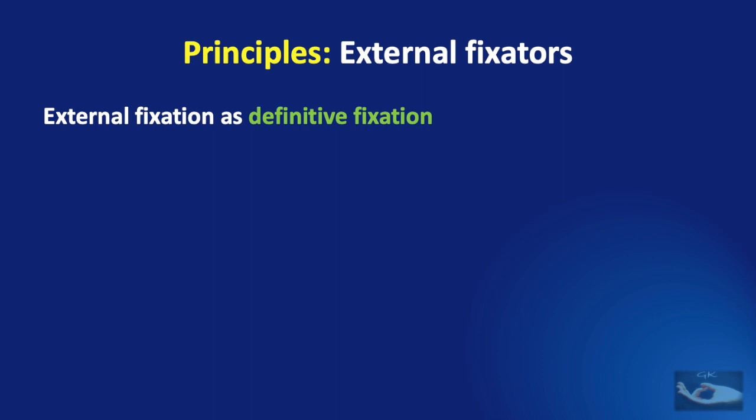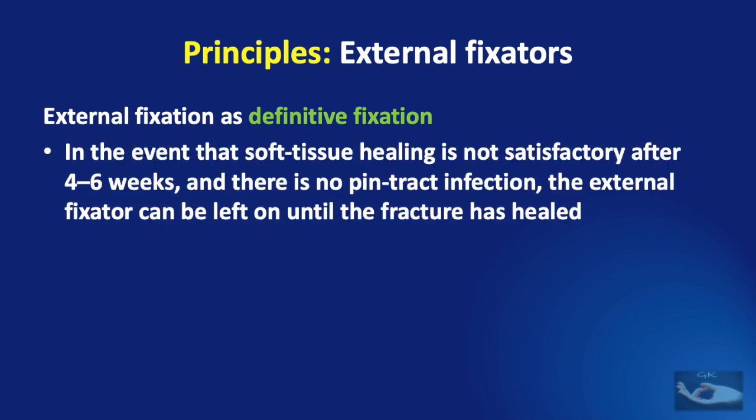The external fixation that we apply can also be used as a definitive fixation in certain situations. In the event that soft tissue healing is not satisfactory even after 4 to 6 weeks and there is no pin tract infection, the external fixator can be left on until the fracture is healed.